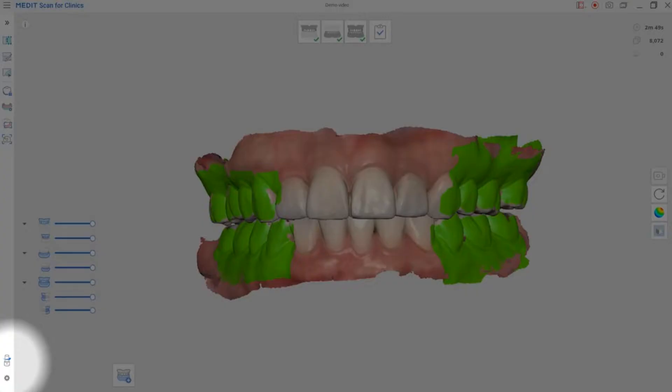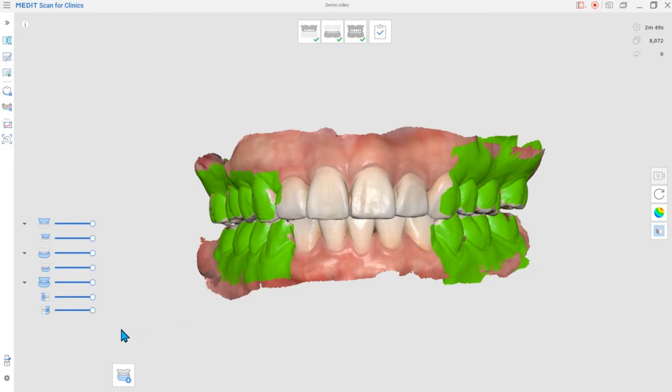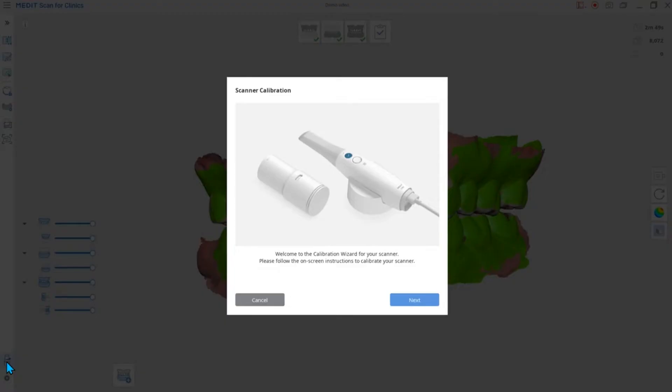The first one is calibration. We highly recommend operating the calibration process periodically for better quality of scan data. The default calibration period is up to 14 days. However, if the quality of the 3D model seems unreliable or the scanning environment has been changed, please calibrate your scanner.